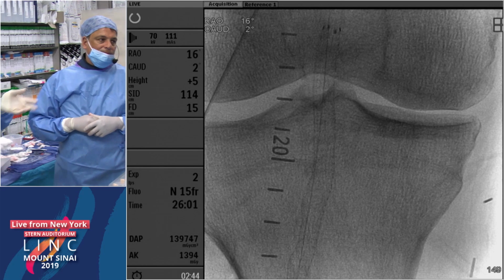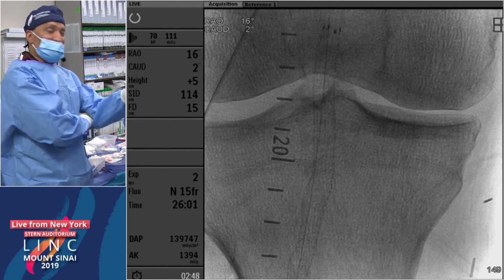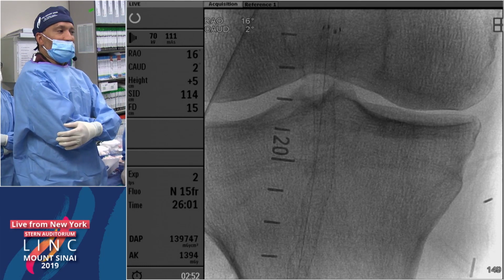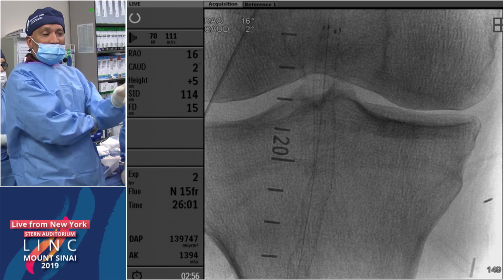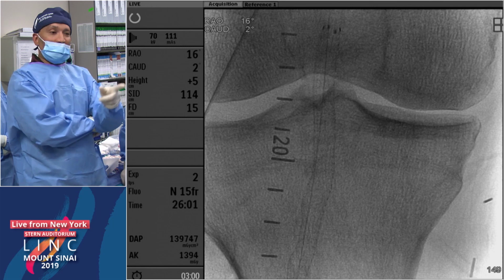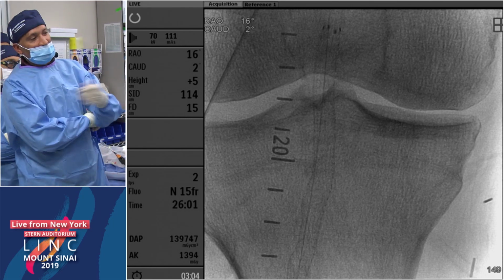We just did 2 cuts. I know it was my suggestion to actually do the second cut. No, it's not PK's suggestion, but I really felt like that popliteal we had to atherectomize because of the significant amount of atherosclerotic burden on the IVUS. Yeah, that's why I thought we needed it, and it was circumferential atherosclerosis on the IVUS. So I think that's why I felt like the second cut was necessary, but I didn't realize that it would.